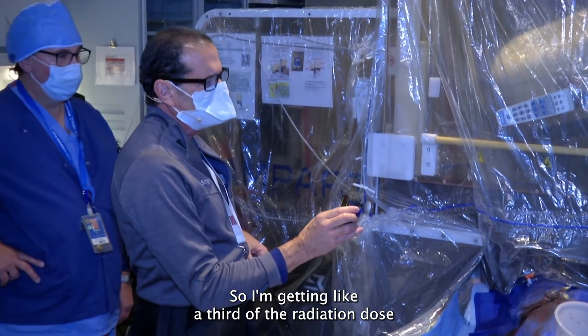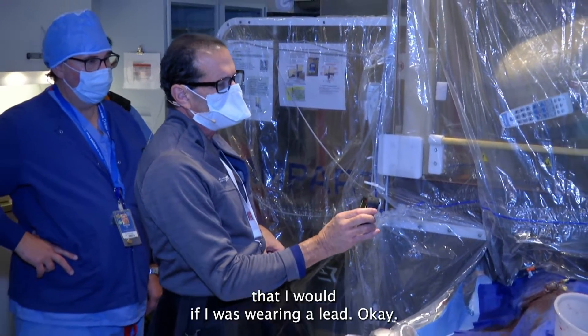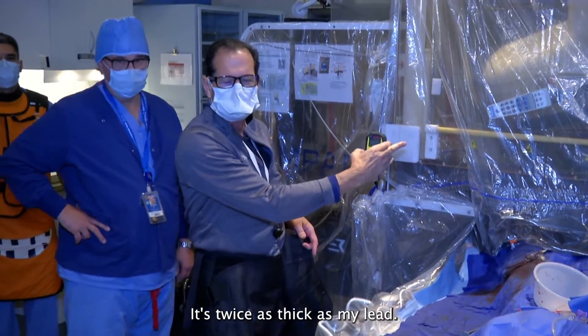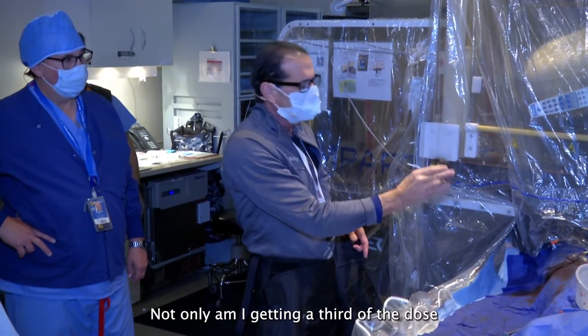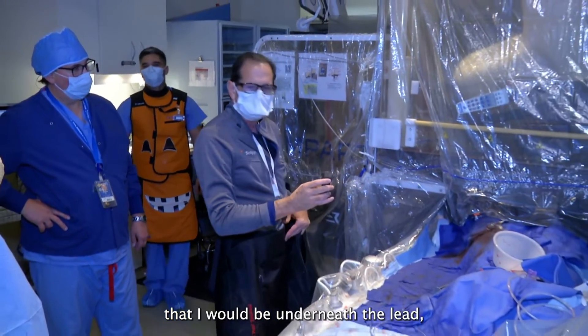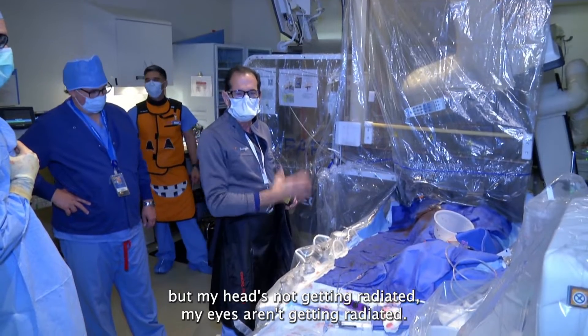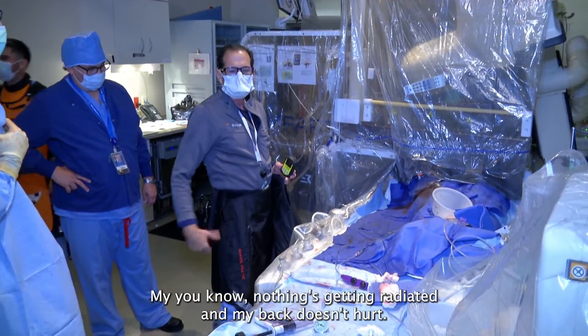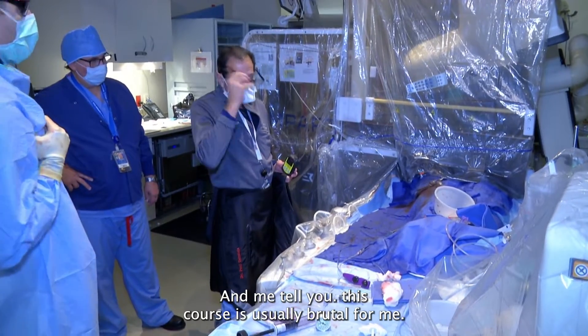So I'm getting like a third of the radiation dose that I would be getting if I was wearing lead alone. This thing is one millimeter — just twice as thick as my lead. Not only am I getting a third of the dose I would be underneath the lead, but my head isn't getting radiated, my eyes aren't getting radiated, nothing's getting radiated, and my back doesn't hurt.